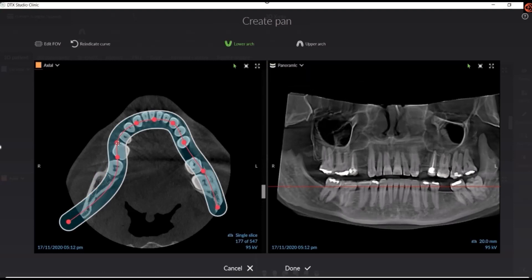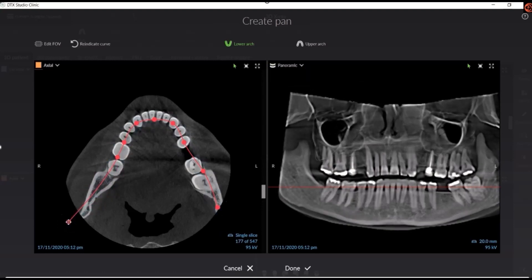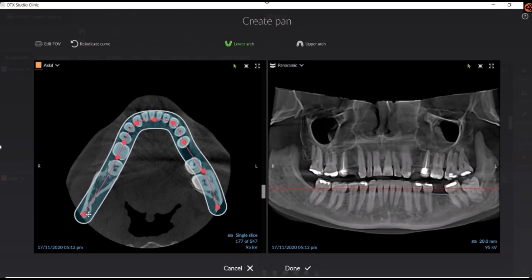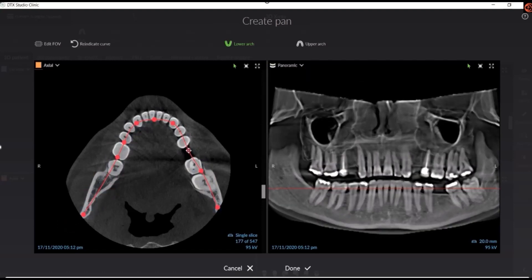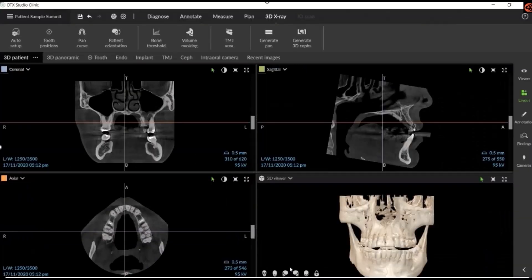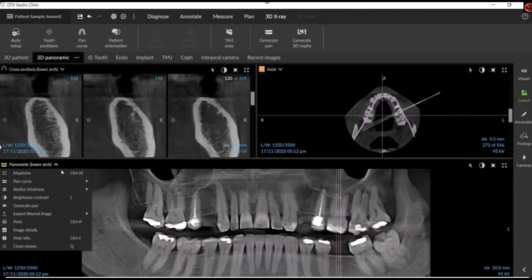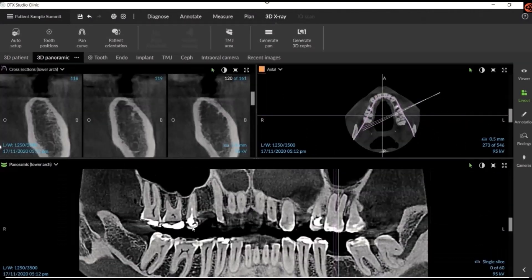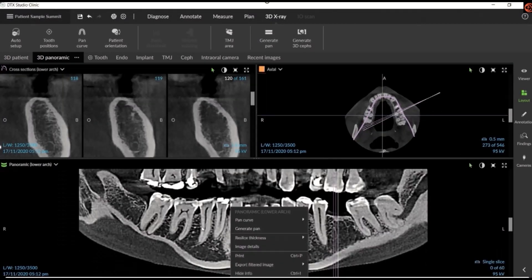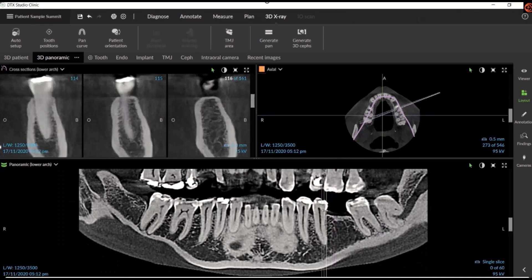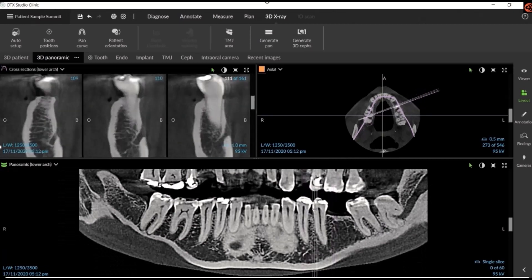In DTX, you can use either the upper or the lower arch, or you can trace both. The pan will be generated from these points. Once we have a generated pan, we can take this pan down to a thin slice and use it to map the nerve.